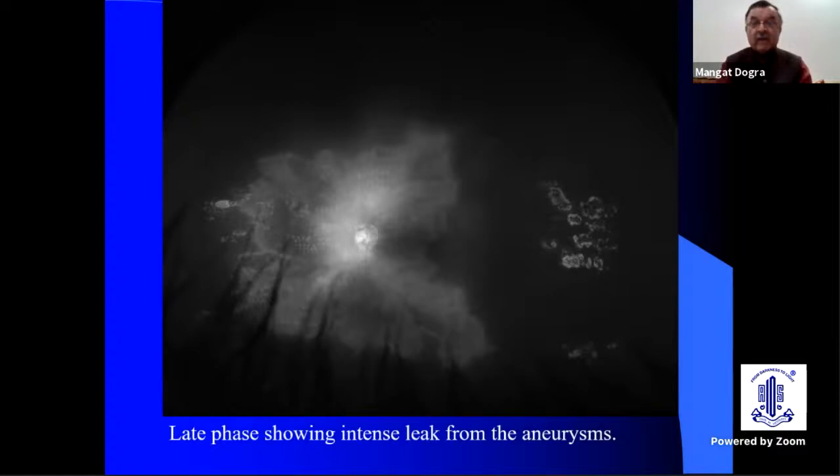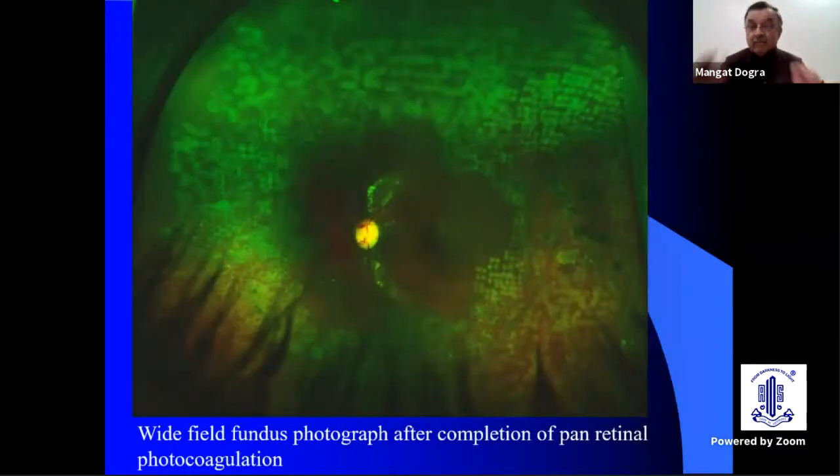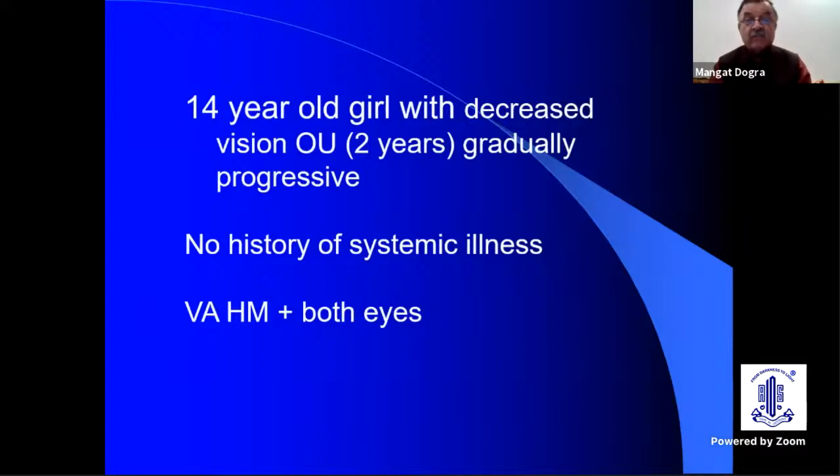And this particular case was finally lasered. And you can see here how much laser was required. You can document everything as well as monitor. I'm not going into the whole follow-up of this case, but you can monitor and you can even retreat if there are certain areas which require treatment. So that is the importance of doing this kind of imaging as well as angiography in these cases.